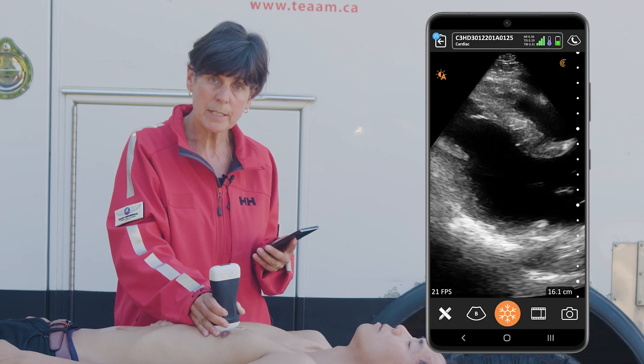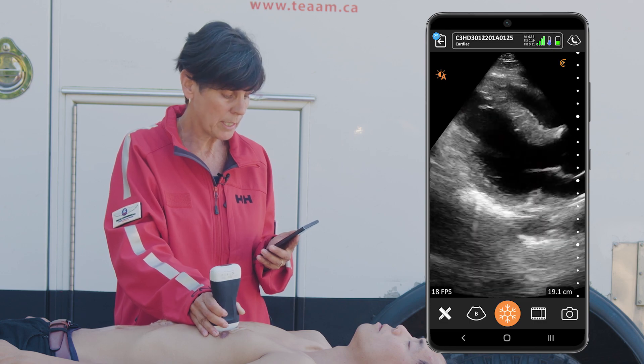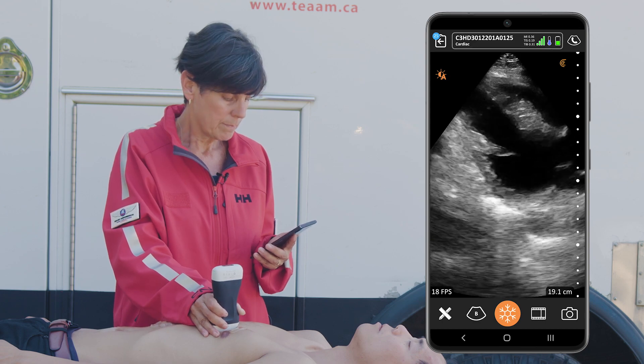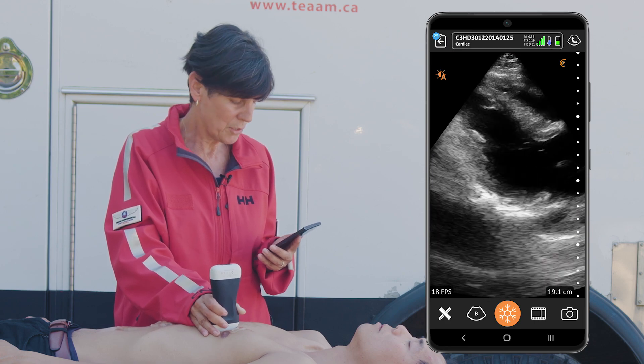The other thing we're going to look for in this spot is pericardial effusion. I'll just decrease my depth a little bit to make sure that I'm getting the entire pericardium in there. We can have a good look by sweeping back and forth, and I'm satisfied that there's no pericardial effusion.